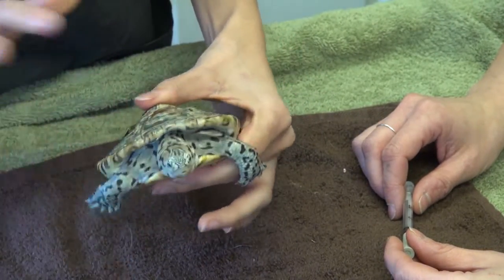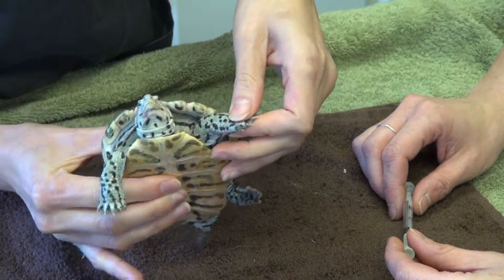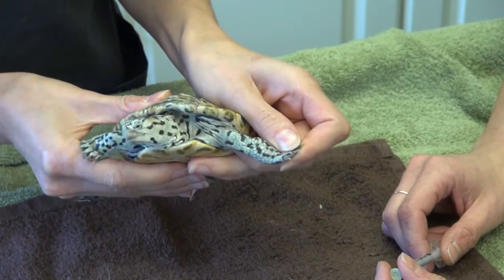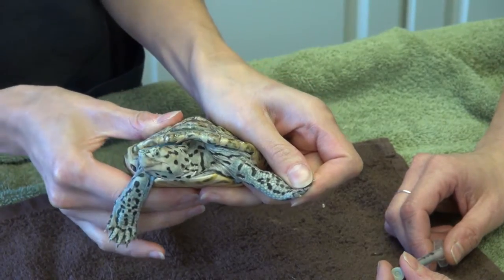Sometimes you can mess with their feet and it'll get their legs flailing, and you can get a hold of their arm and hold it out. It might be a two-person job depending on how your turtle or tortoise acts — they either act like this or the complete opposite, completely in their shell.